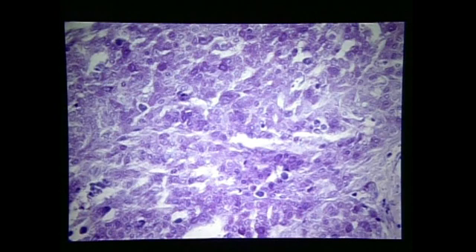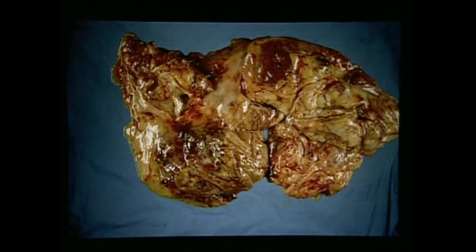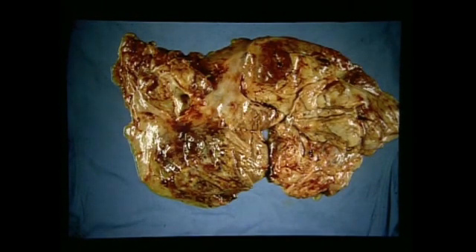And also a second case involving the liver and other viscera was a mast cell tumor, a disseminated mast cell tumor showing metachromasia. This horse had clinical signs of fever of unknown origin and an eosinophilia. Here is a set of mediastinal lymph nodes involved in the process of neoplastic transformation and infiltration by mast cells.